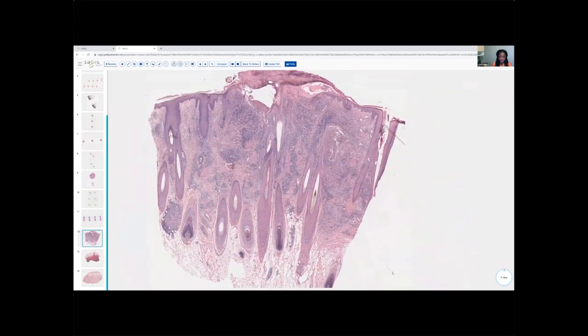But for some reason, it just cuts off once we get to the subcutaneous tissue. It doesn't go into the subcu. It's really just tracking along the length of the hair follicle that is infundibular and isthmic, right? It does not bother at all with that bulbar zone and into the suprabulbar zone. So that is a diagnostic feature.